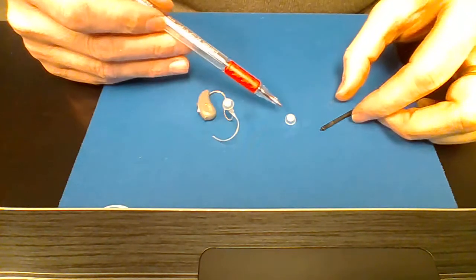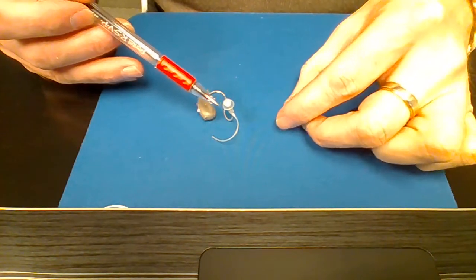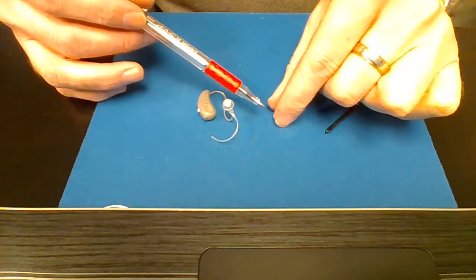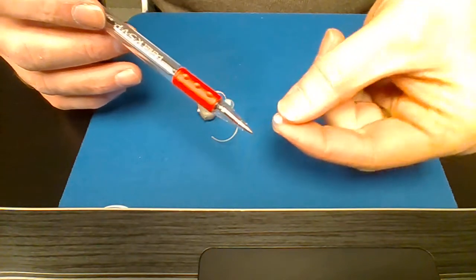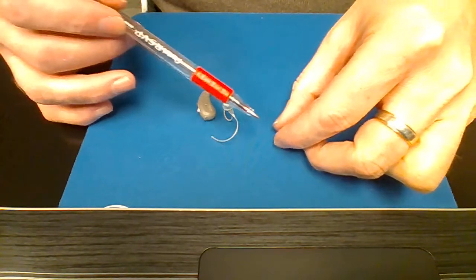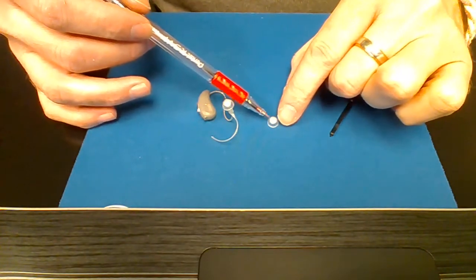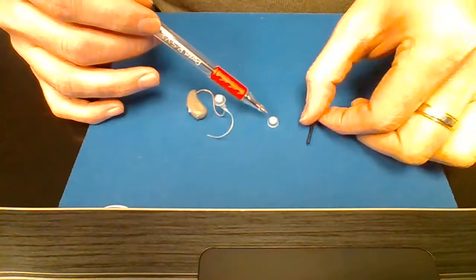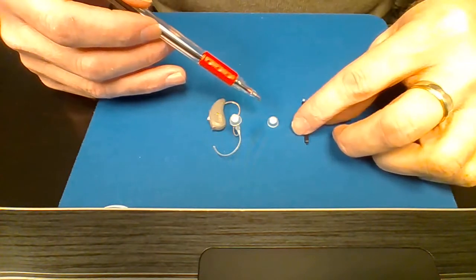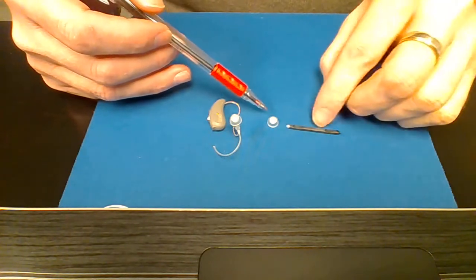Now you will need to have a replacement dome that is exactly the same as the one that you were given at your initial fitting. Okay, you don't want to change that or put on a different one. This is what the dome will look like. On this one, this is a closed dome, but you could have many different styles. You can have double domes, smaller, larger ones that are open or closed, and you can look at one of our other videos on the differences in the domes if there's any confusion, or you can call your provider and ask them.